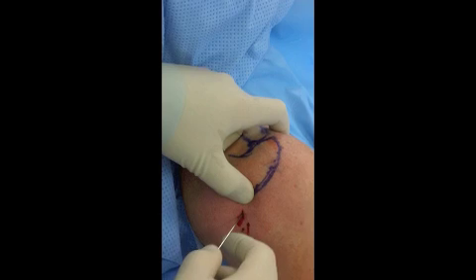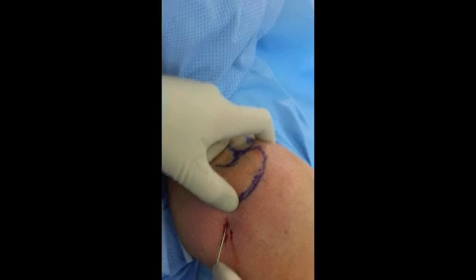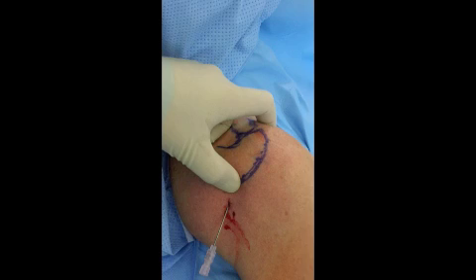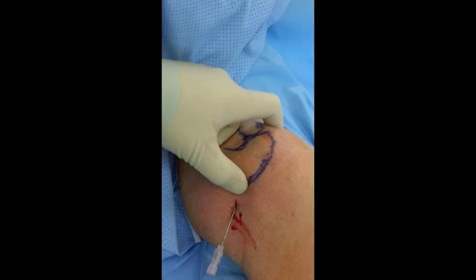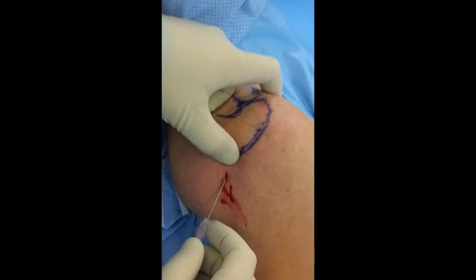If you want to do a subacromial injection, the entrance is the same, except you lower your hand to go underneath for the subacromial space. This is something we see in the office setting, but rarely done in the ER setting.